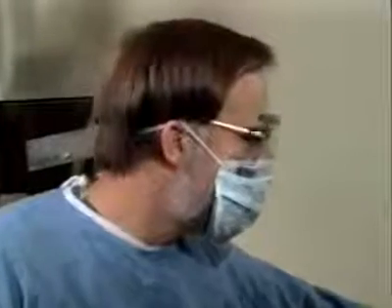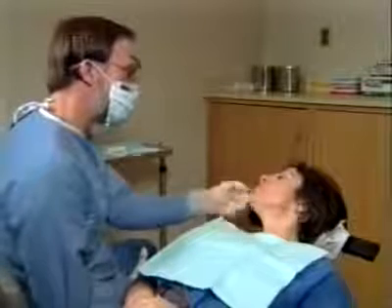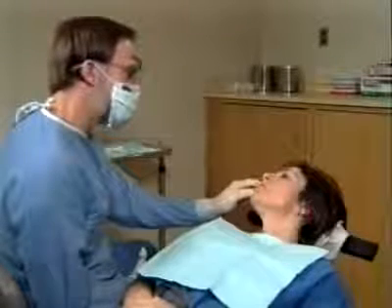For a right-handed operator performing a right infraorbital nerve block, the clinician should be seated in front of the patient, with the patient's neck extended and the head turned to permit visualization of the right premolar region. The mouth may remain closed. The left index finger is placed over the infraorbital foramen, and the upper lip is retracted by the thumb, pulling taut the tissues in the mucobuccal fold.